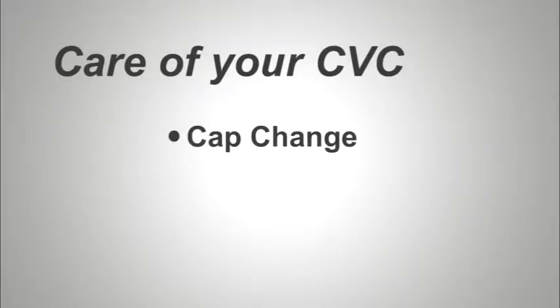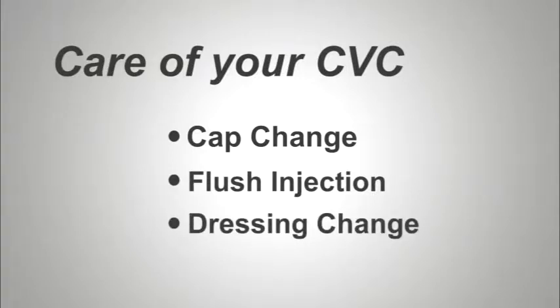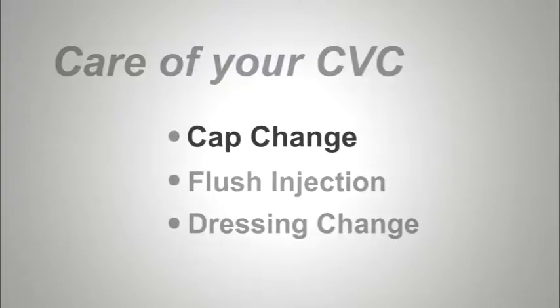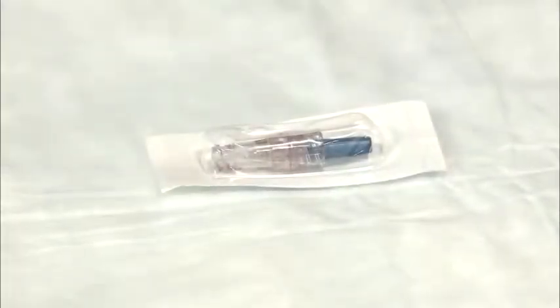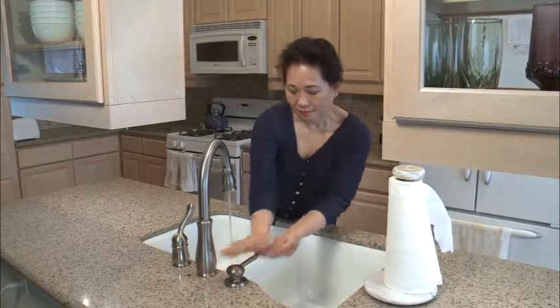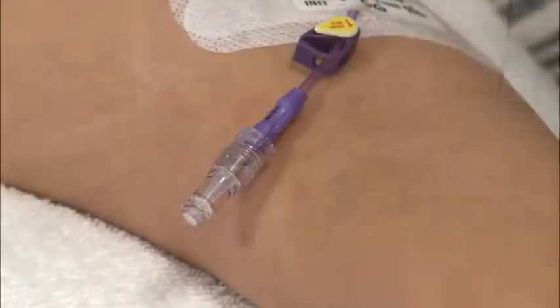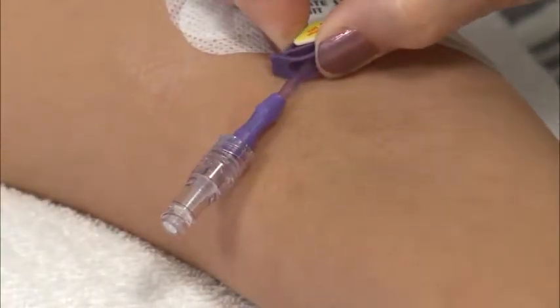Those are the weekly needleless connector cap change, the flush injection to keep your CVC open, and the CVC sterile dressing change. For the weekly cap change, first gather a new sterile cap for each extension. Wash your hands briskly for 15 seconds and dry with a clean towel. Close the clamp on the CVC.